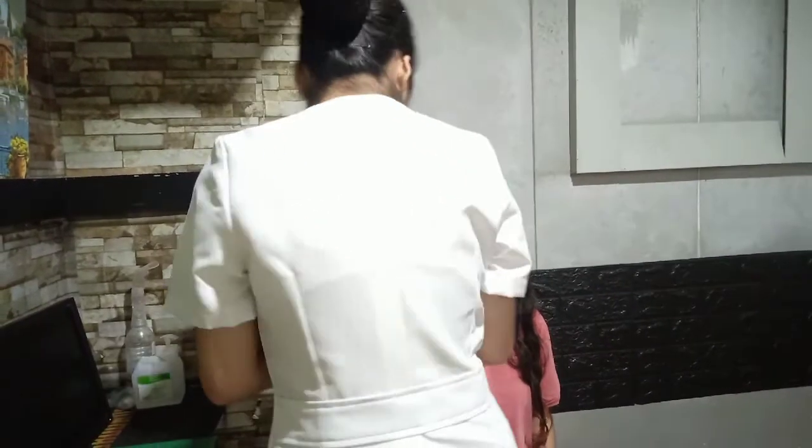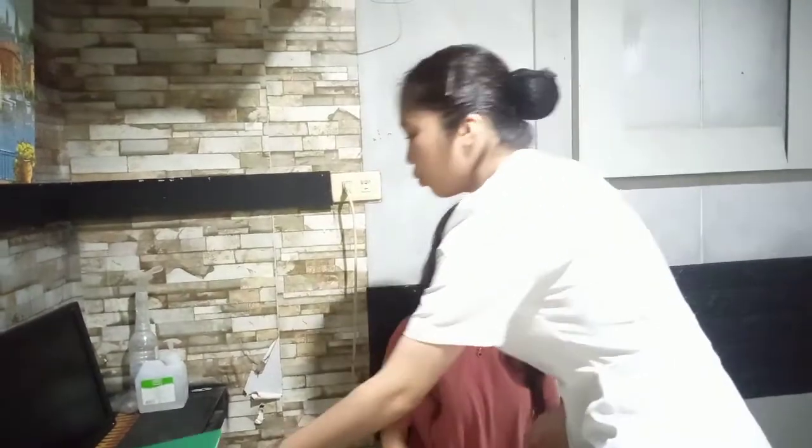And also perform hand hygiene. Ms. Shensen, let me record what happened right now. Thank you again for your participation, Ms. Shensen. I hope it all goes well for you, and I hope you have a nice day. If you have any questions, you can call for me or other nurses for assistance. Thank you. Thank you. Have a nice day.